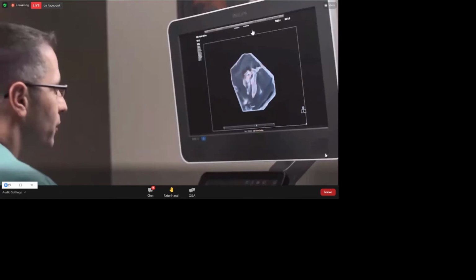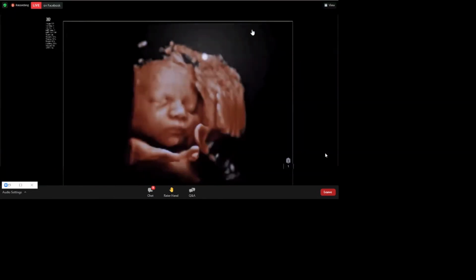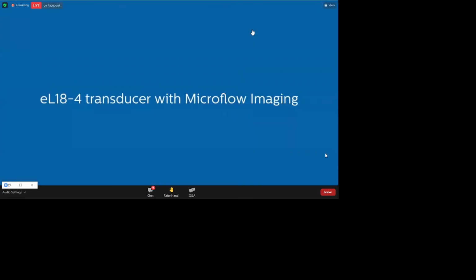your patient. Philips has provided us with tools that were incredibly useful, faster, better image quality. We are seeing an evolution of ultrasound which is truly remarkable. The advances are truly useful. They are helping us with efficiency, they're helping us with detailed image quality, and providing the patient an incredibly enriched 3D volumetric experience. And I can't wait to see what the future is going to hold.